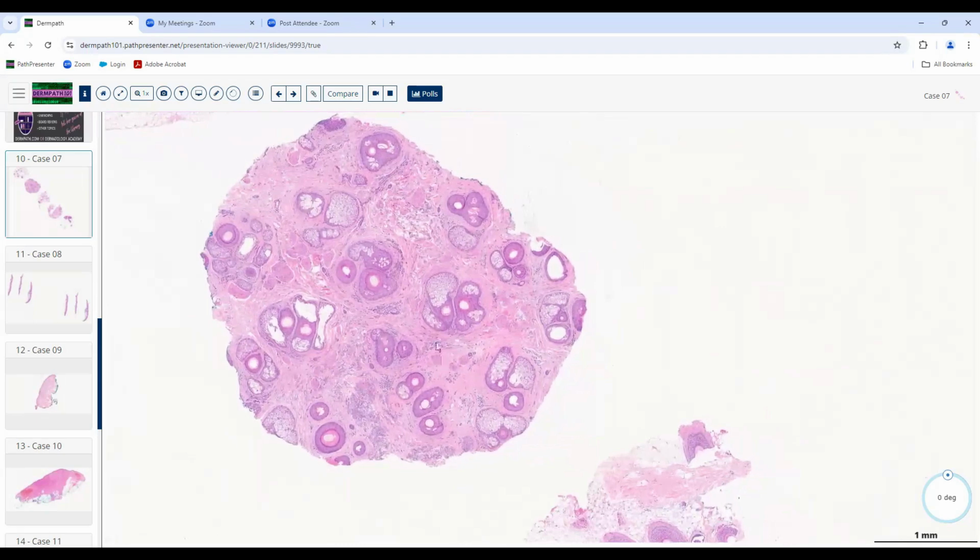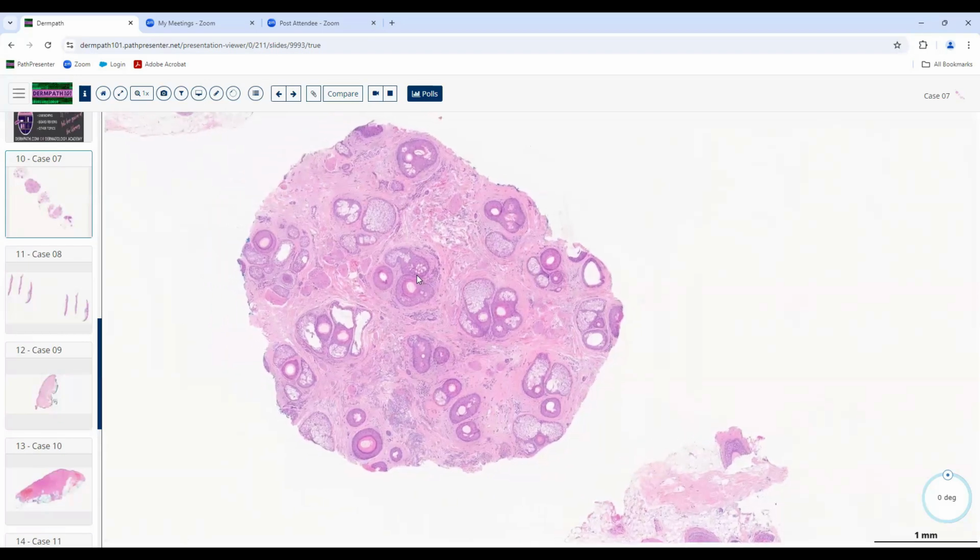And so when you're looking at something, this would be just beneath the level of the infundibulum and the isthmus. So you're seeing the sebaceous lobules, so you can imagine, this is something like a CAT scan, if you will, as opposed to just a regular plain film. Or maybe this is like confocal microscopy rather than looking at regular H&E type sections that we cut perpendicular to the tissue. So here you're seeing the multiple sebaceous lobules with an increase in the number of these small miniaturized follicles with virtually no inflammation.